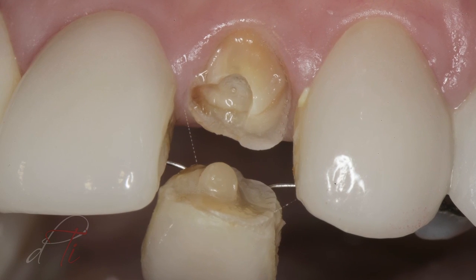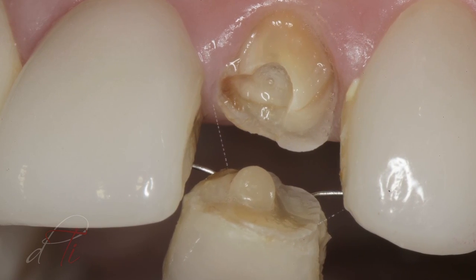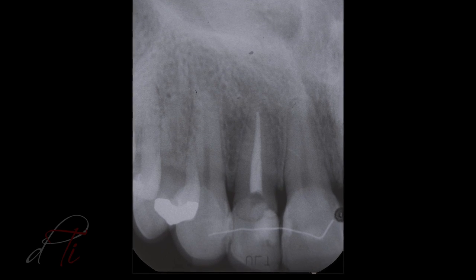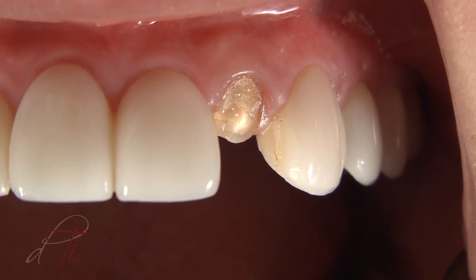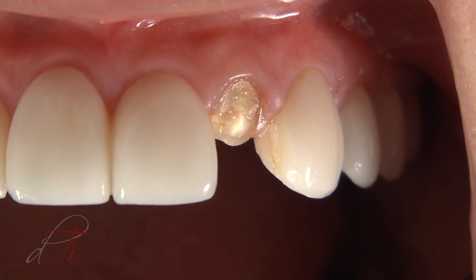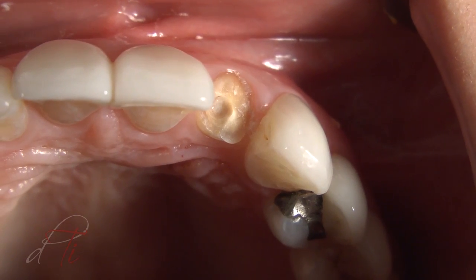A female colleague presents with a restorative failure of a ceramic veneer on an endodontically treated maxillary left lateral incisor. After radiographic review and evaluation with the patient, an initial emergency treatment plan was discussed. The previous veneer restorations were improperly bonded with gingival inflammation at each interface. Initial treatment would include placement of a fiber reinforced post and core and a provisional restoration, followed by a complete aesthetic and restorative evaluation.